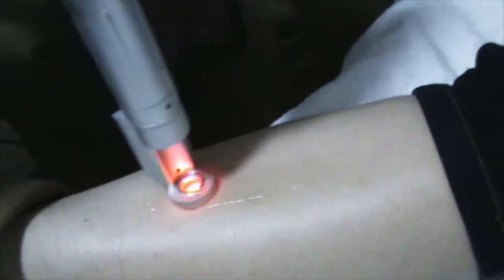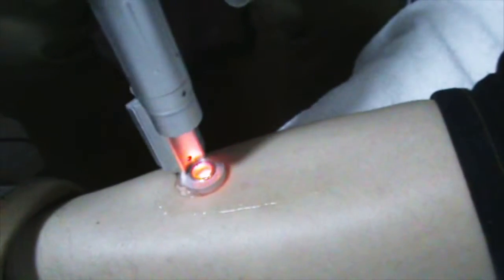Before treatment, we can use the tip to touch the skin. You can feel this place is cooling. About two or three or five minutes, so we can start treatment.